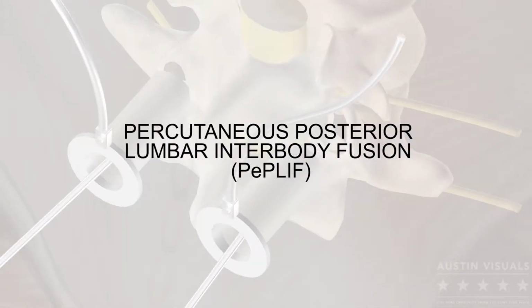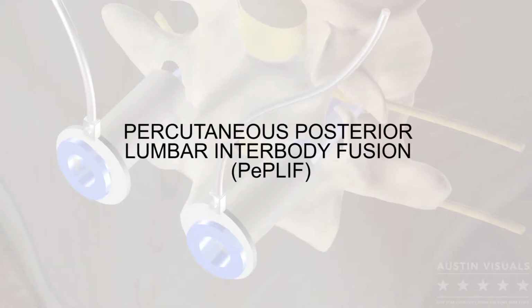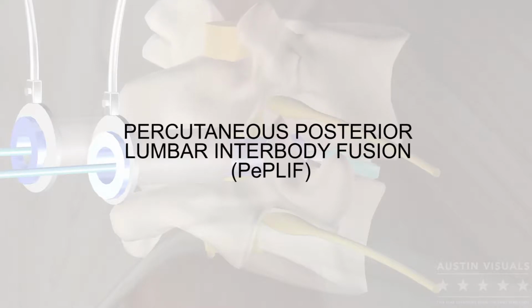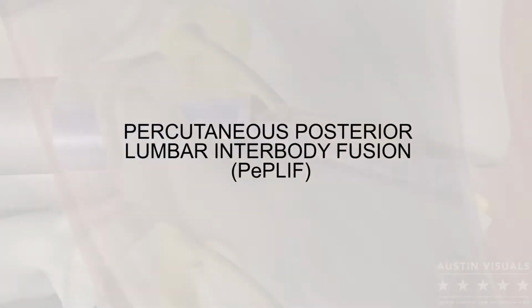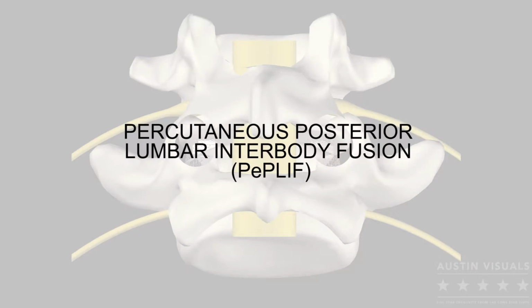Percutaneous posterior lumbar interbody fusion, percutaneous PePLIF. This novel concept to lumbar interbody fusion combines two emerging technologies in spinal surgery: 1. Ultrasonic bone and disc removal, and 2. Expandable interbody cages. In percutaneous PePLIF, the surgeon can access the lumbar disc percutaneously, minimally invasive and with the use of a wide range of navigation options such as C-arm fluoroscopy or more advanced CT MRI-based systems.